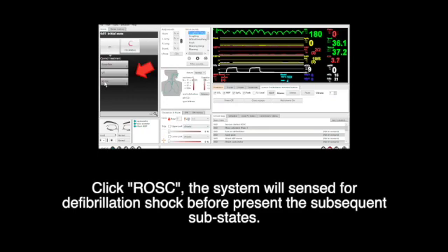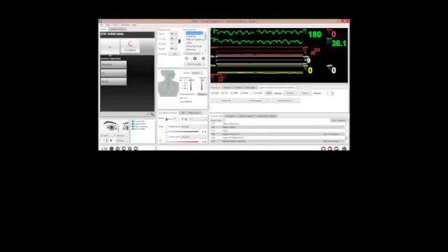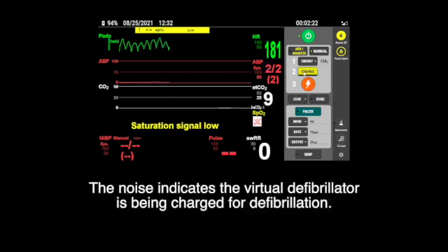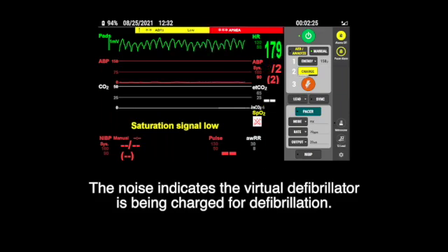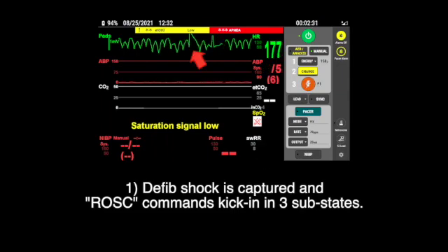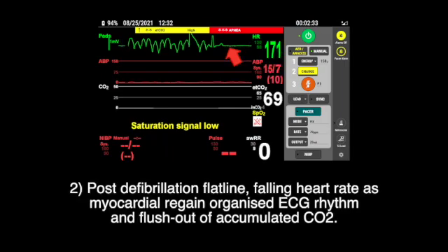Click ROSC — the system will sense for a defibrillation shock before presenting the subsequent substates. ROSC has been activated, but post-defibrillation commands will only activate upon defibrillation being detected. The noise indicates the virtual defibrillator is being charged. Defibrillation shock is captured and ROSC commands kick in across three substates: post-defibrillation.